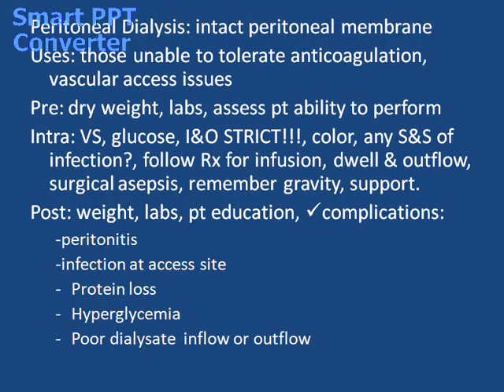And when I talk about milking, it's to pull on it and try and break the clot up inside the tubing. We're going to check for any kinks or closed clamps if we're having trouble with the flow, and we're going to tell the client to avoid constipation by using stool softeners, because think if they're all constipated inside, they could be causing an obstruction too because they're filled up with stool.